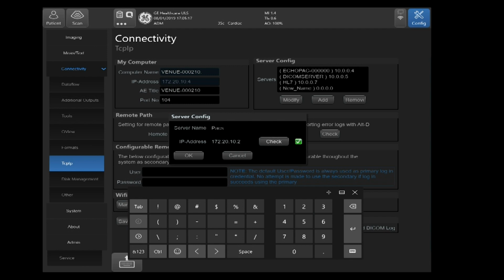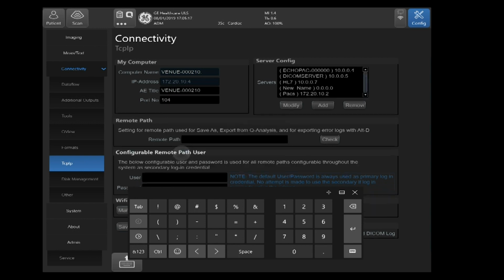We'll go ahead and click on check. Green check indicates we have good communications from the back of the ultrasound machine to the back of the device where the PACS software is running. Go ahead and select OK.